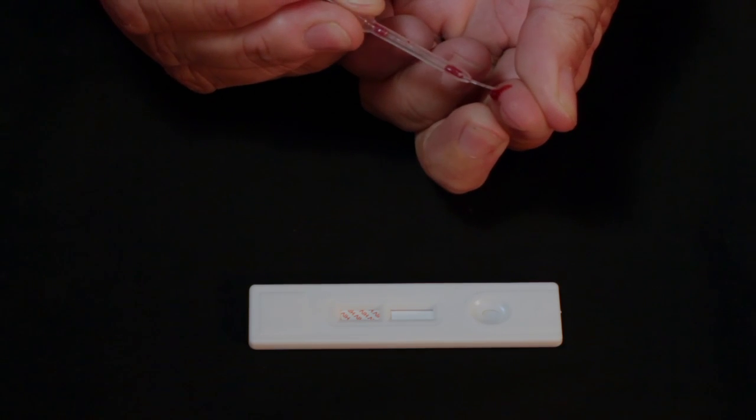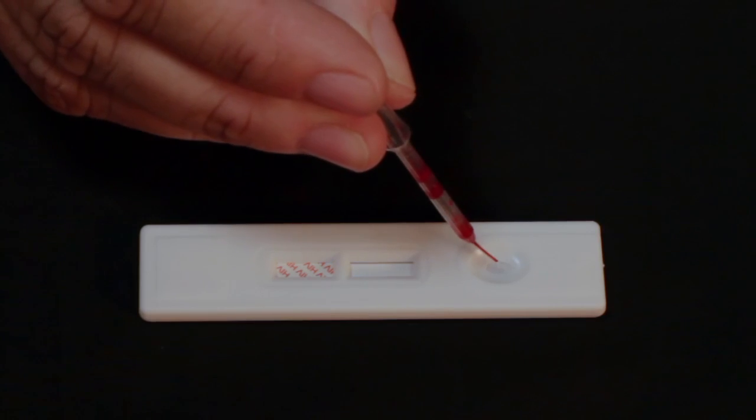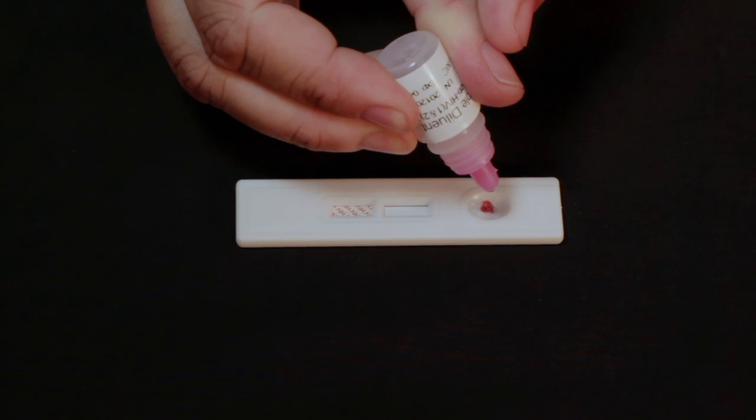You may need to squeeze the finger several times to produce enough for the sample. Next, add one drop of blood to the well on the test device. Add two drops of developer to the blood sample in the well.